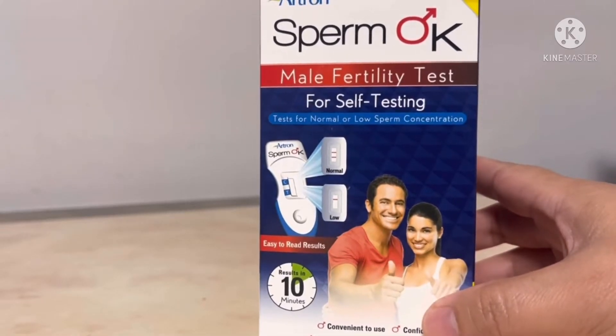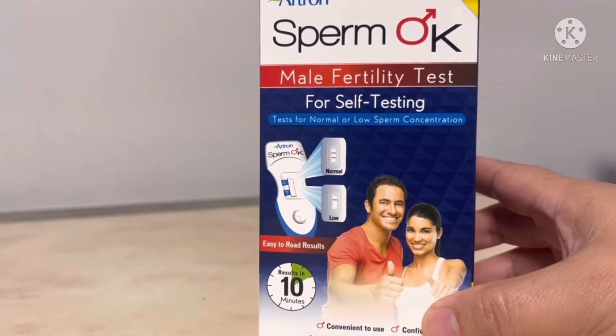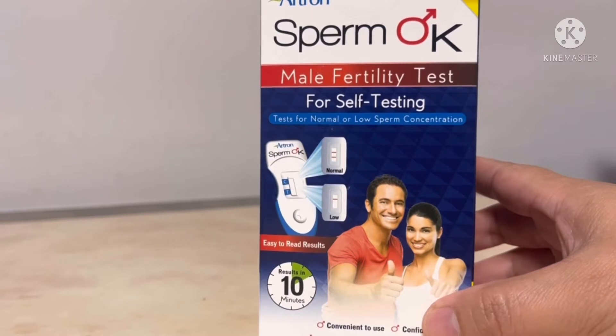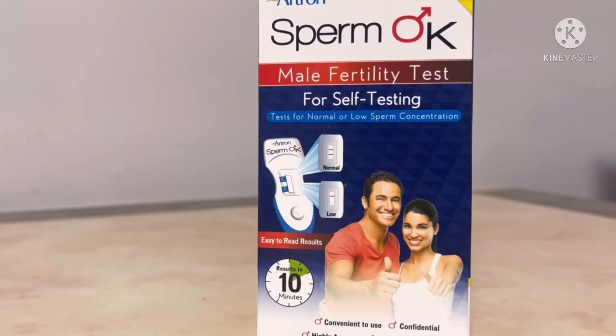Let's begin. This is a sperm test — a male fertility test for self-testing. You can usually do this in your home, so let's see what's inside.